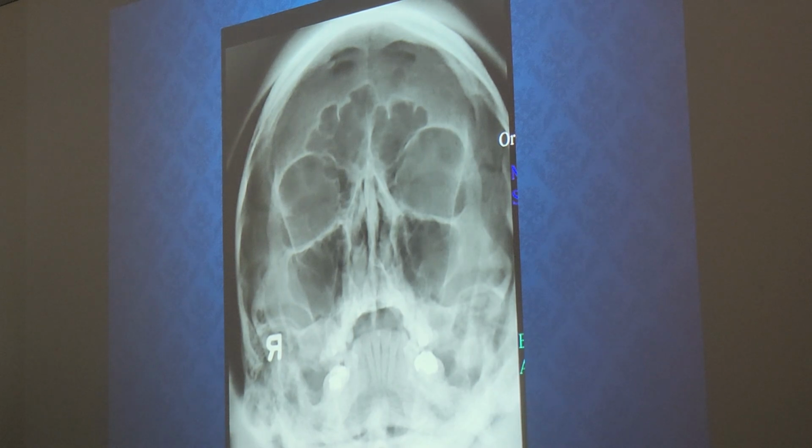What projection or position is this? Waters. So look at what? Air sinus. Who can I ask? What are these? Those are frontal sinuses. Yes. Maxillary sinuses. Okay. One more. What are these? Is it lacrimal bones? Not a bone. We're looking for sinuses.